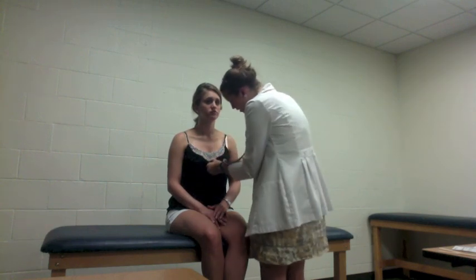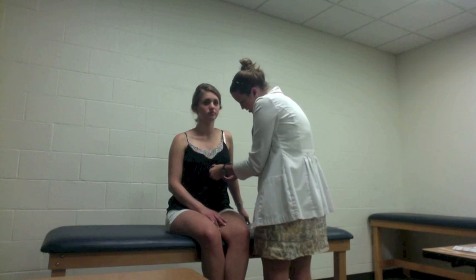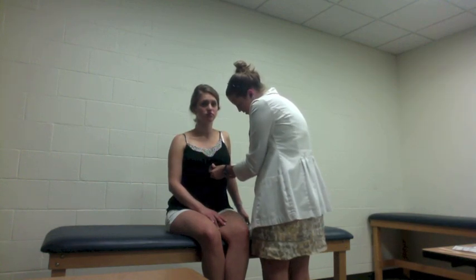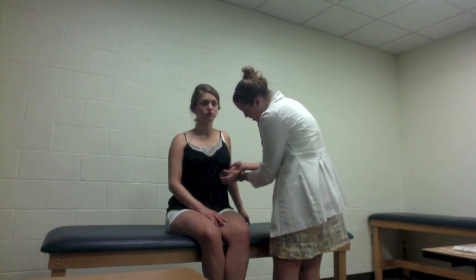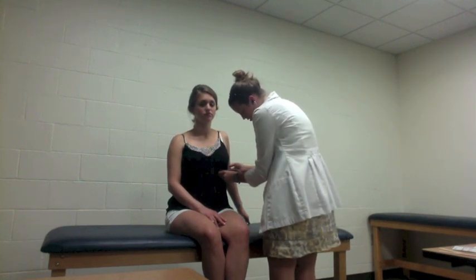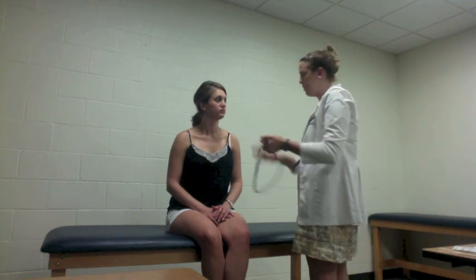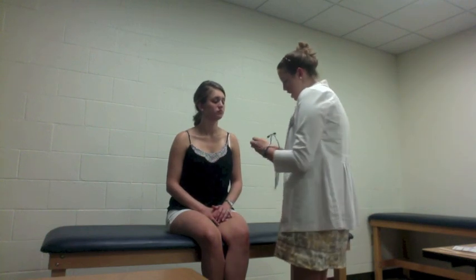Moving down to the fifth intercostal space. Okay. Since you're sitting, I would also have you lay down and listen to the exact same points again, but just for the purpose of this exam, I'll just listen to you sitting up.